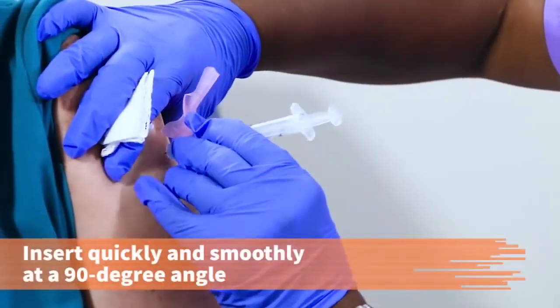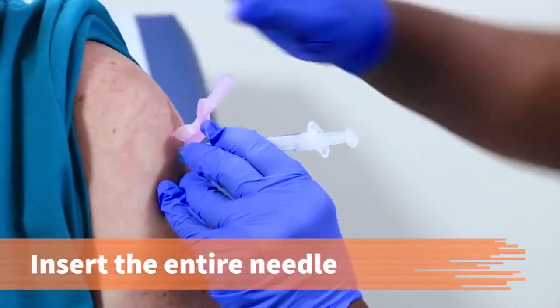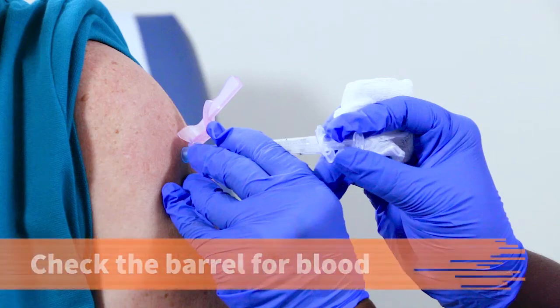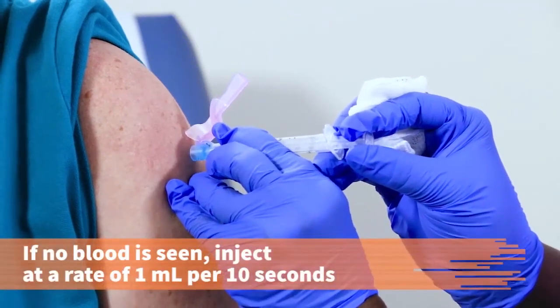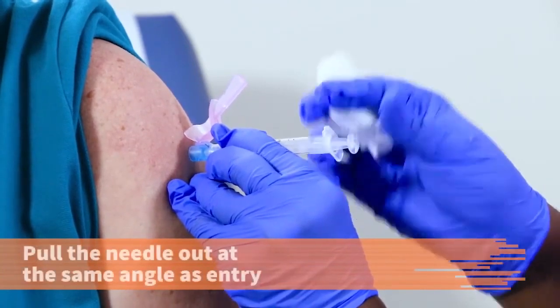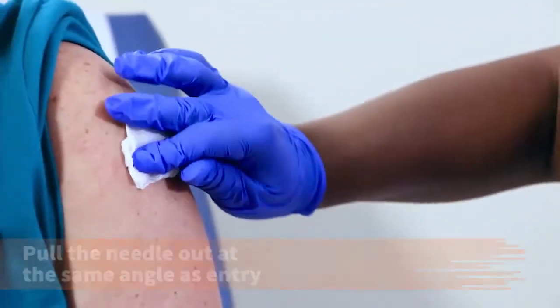Quickly and smoothly insert the needle into the site using a 90-degree angle depending on the needle size. Insert the entire needle. It is important to aspirate before giving an intramuscular injection. Check the barrel of the syringe for blood. If blood is seen, pull out the needle and discard. Then restart the procedure. It is important not to give the injection if the needle is in the bloodstream. If no blood is seen, inject the medication at a rate of about 10 seconds per milliliter. Ensure all the medication has been injected before pulling out the needle at the same angle as entry.